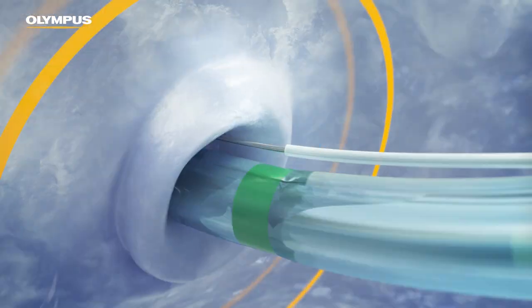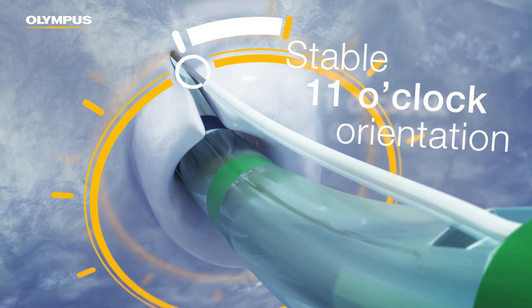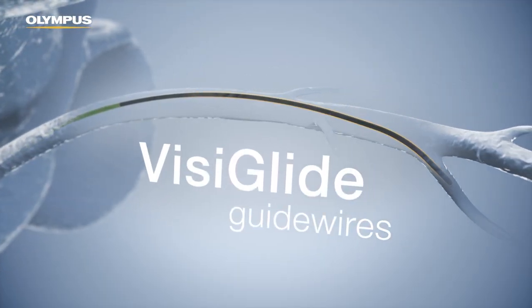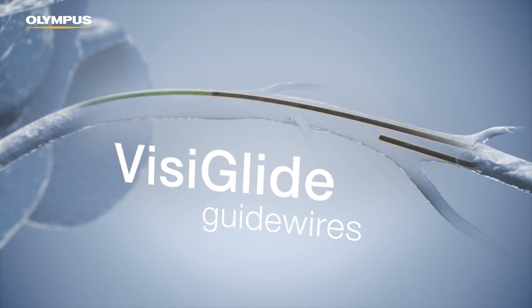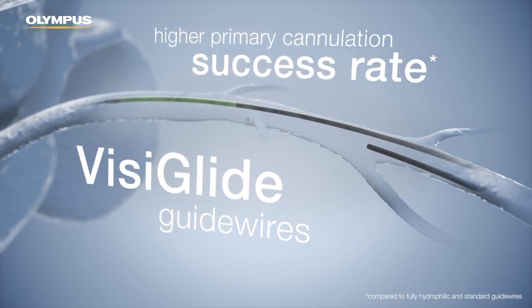CleverCat3V sphincterotomes consistently extrude to a stable 11 o'clock orientation for bile duct cannulation. The flexible tip and uniquely constructed body of VisiGlide guide wires enable a higher primary cannulation success rate.